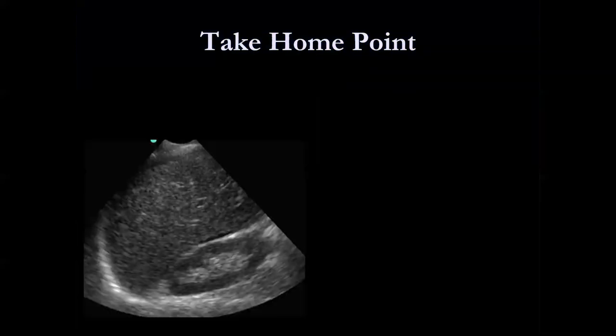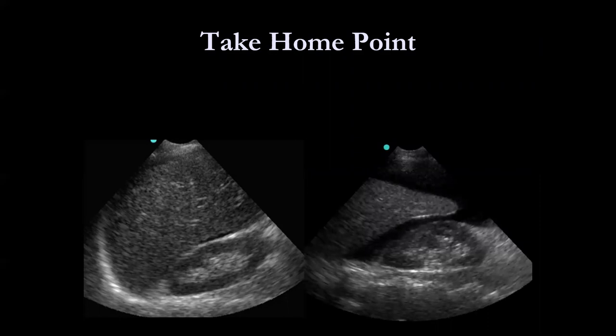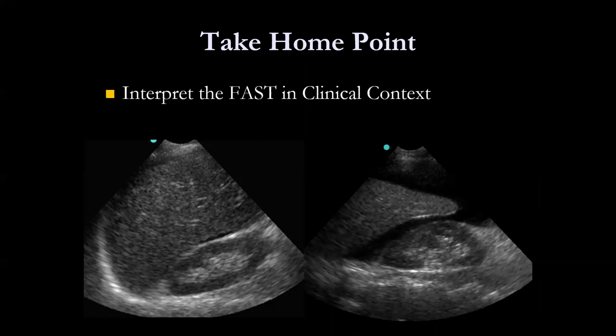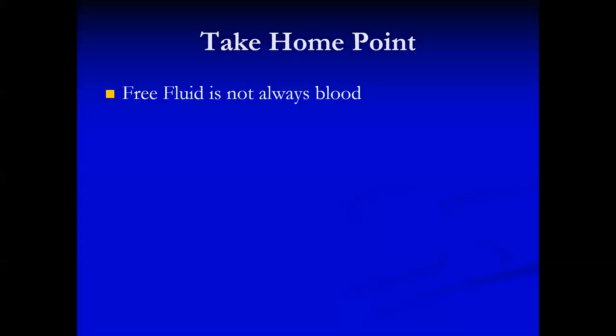Take into account what's going on clinically with the patient. If you have a patient with a small amount of free fluid and they are grossly unstable, something else is going on — do they have pericardial tamponade? This small FAST is not causing them to have no blood pressure. On the other hand, if you have a known cirrhotic alcoholic who came in as a trauma after falling off a bar stool, and there's a whole lot of free fluid, think — his blood pressure is 150 over 90, heart rate is 70, he's joking around — that's probably ascites. So interpret the FAST in the clinical context. And remember, free fluid is not always blood; it could be ascites, peritoneal dialysate fluid, or urine if the bladder is ruptured.